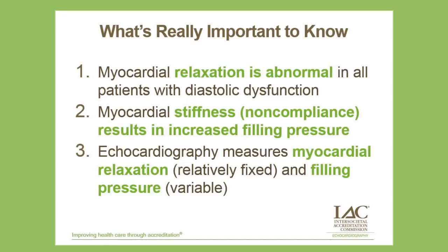First of all, you need to know that myocardial relaxation is abnormal in all patients with diastolic dysfunction. If you remember the little animation that we just saw, with normal relaxation, we have very quick initial diastolic filling. But once you move to grade 1 diastolic dysfunction, you have delayed myocardial relaxation. So it doesn't matter what grade of diastolic dysfunction you're in, myocardial relaxation is abnormal.